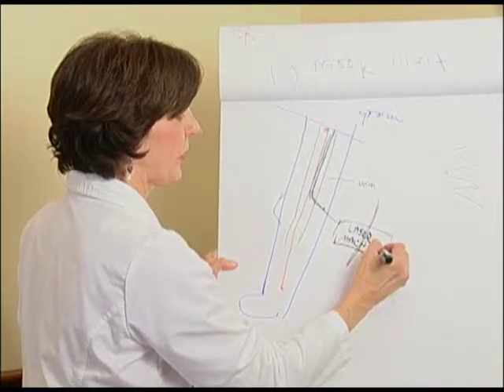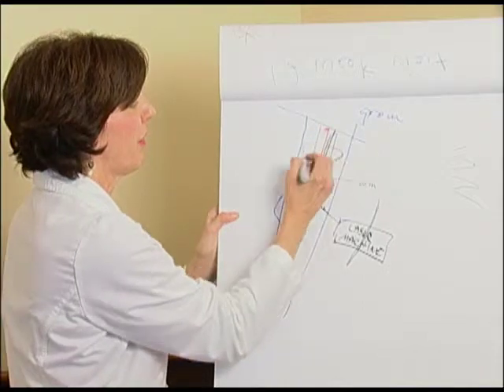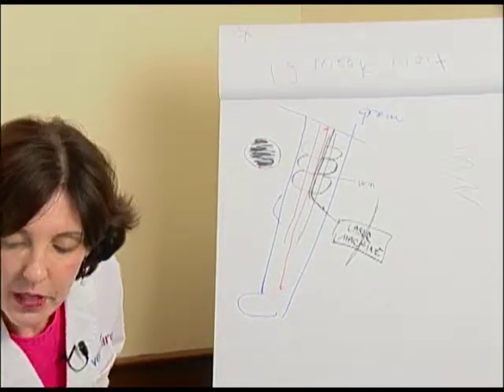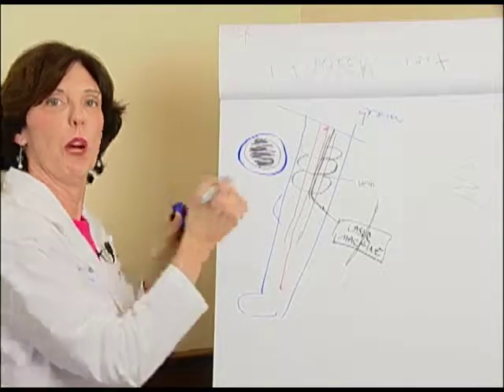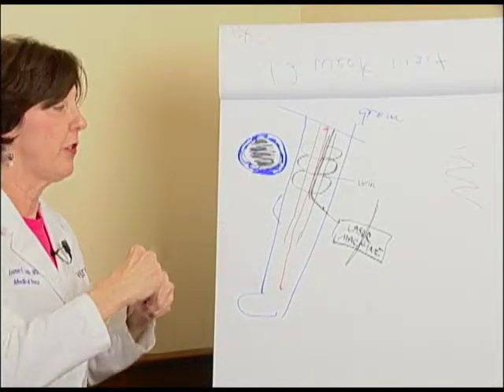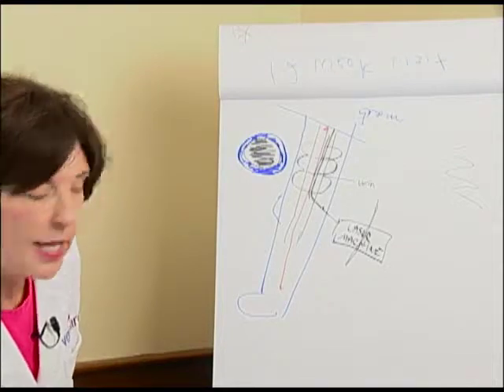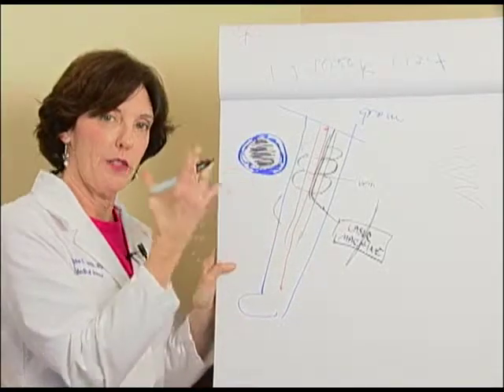Now, probably the most important part of what we do is we put fluid around the vein. Now, let's pretend you were a burning brush in your backyard. You'd put it in a pile, and then you'd surround it with water or dirt. Actually, that was good. It's blue for water. So you surround it with that, and the main reason is that you don't want the heat or the flames to spread and get your lawn, bushes, etc. Well, we do the same thing. We want the heat to stay within the vein. We do not want to injure or have the heat affect any of the tissue around it.